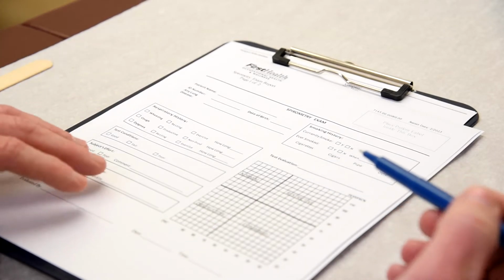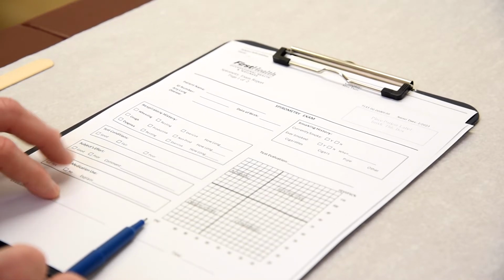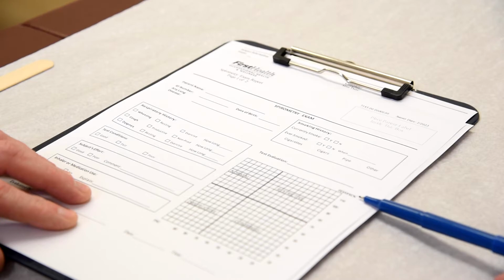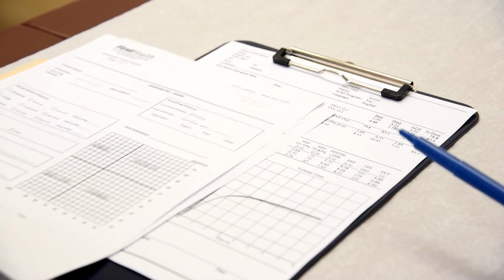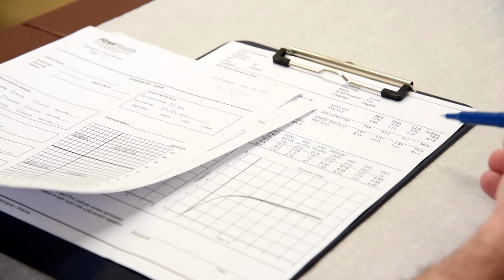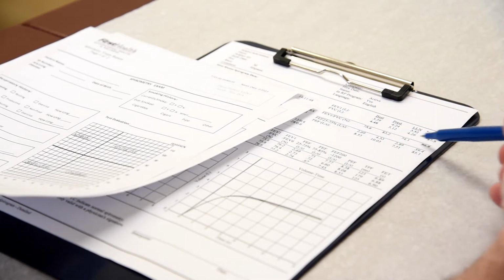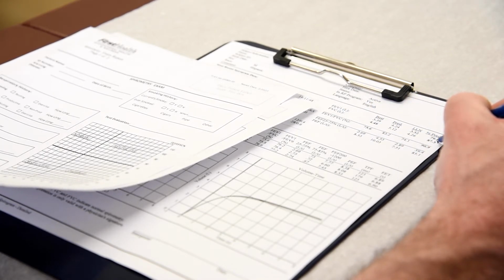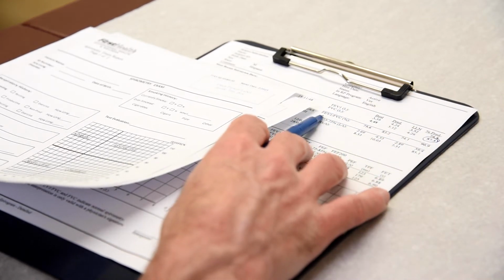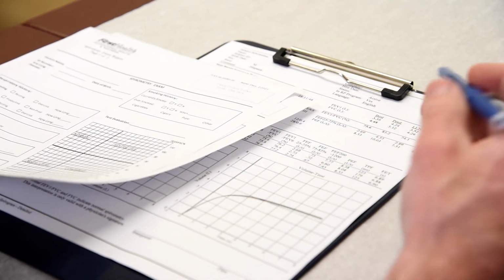So first of all, let's take a look at this. If you look at the bottom of the graph, you will notice FVC. Also, looking up the side, you will see FEV1/FVC percentage. So what we will do is we'll come to our results page and we'll identify up here at the top predicted, and we'll find our FVC and come over. So our FVC predicted is 87.5. And then we will find our FEV1/FVC percentage and come all the way over to the percent predicted.